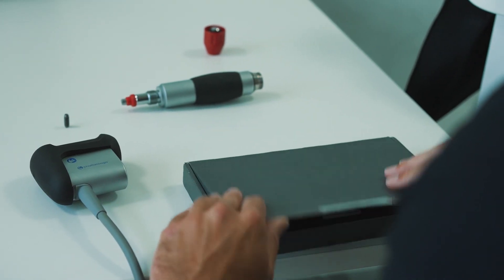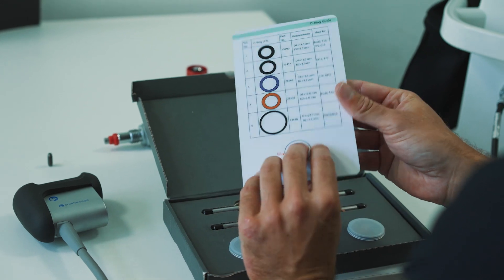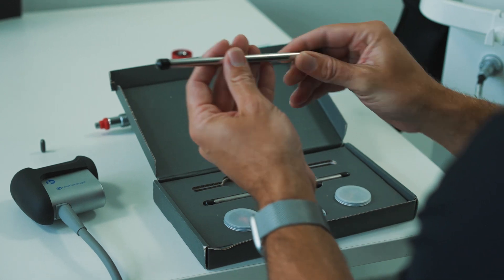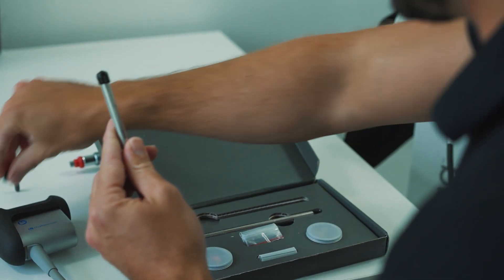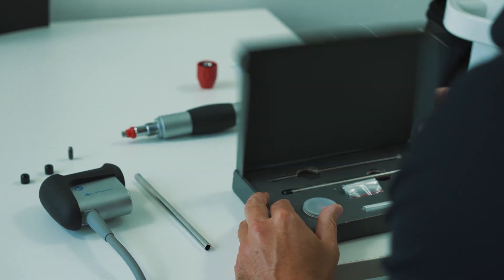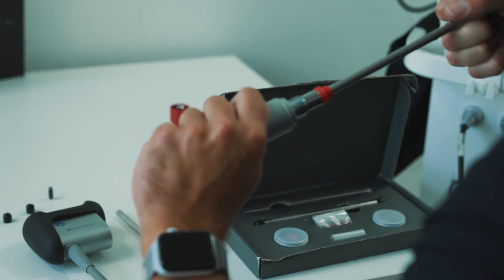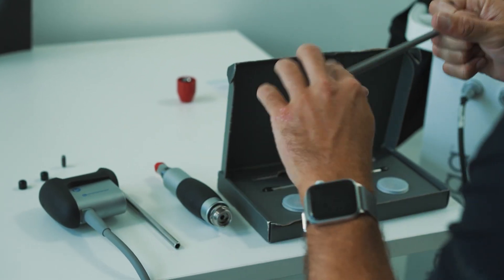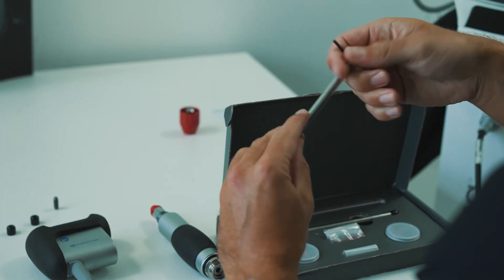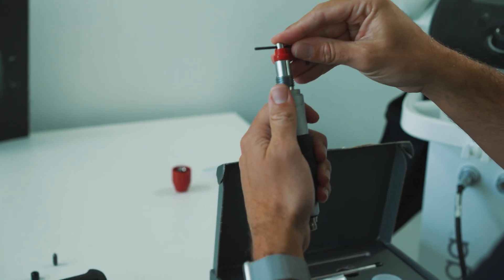Next we're going to open up our revision kit. There's a guide in here on how to replace your O-rings, which we'll come to in a moment. First, we're going to replace the guide tube that the projectile travels inside. Remove the two rubber stops and grab your Allen key. Insert the Allen key through the two holes and slowly, using a pulling and twisting action, remove the old guide tube. Then place the Allen key through the new guide tube and insert it back into the barrel, ensuring that it's fully secured.